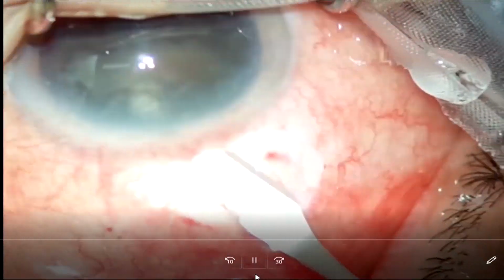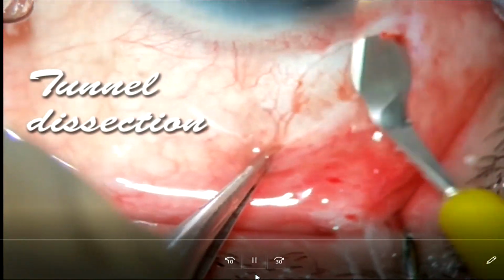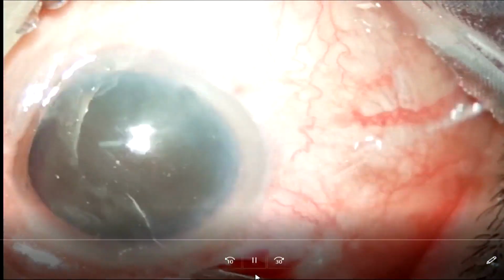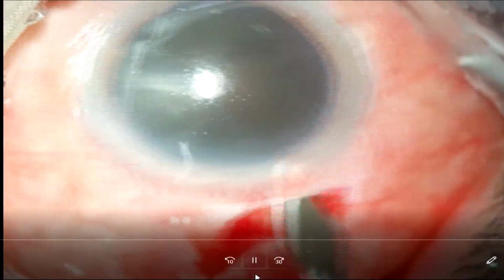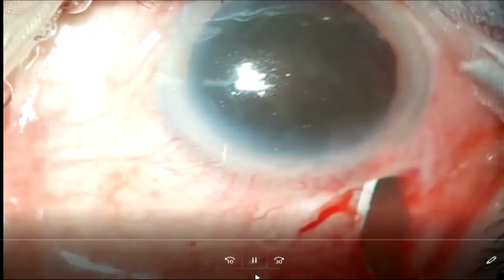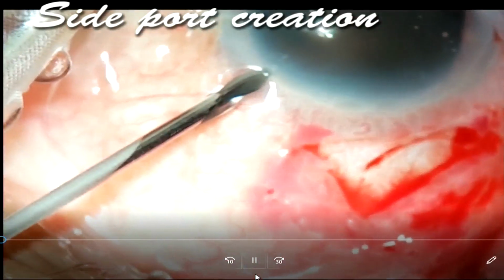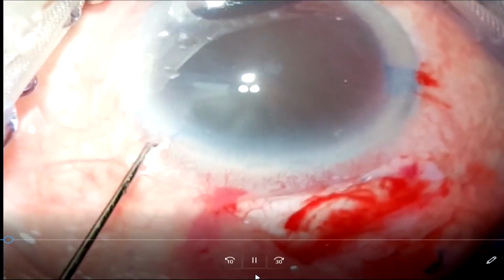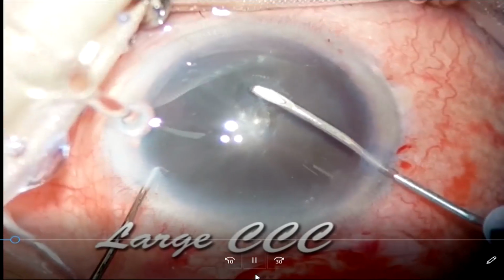This is a frown incision, and this is the 0.5 millimeter depth of the external incision, followed by a crescent knife being used to dissect further into the cornea, about 1.5 to 2 millimeter. It is very important to use blades that are sharp, otherwise you don't have a very good dissection. I create 2 side ports nowadays instead of 1. It helps in stabilizing, especially if you're trying to do a topical.